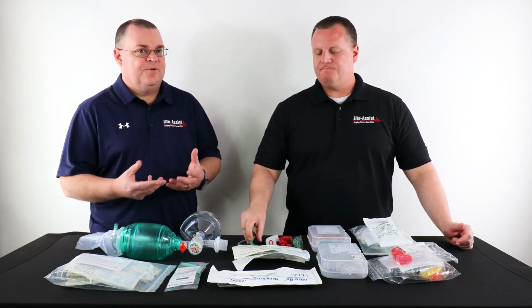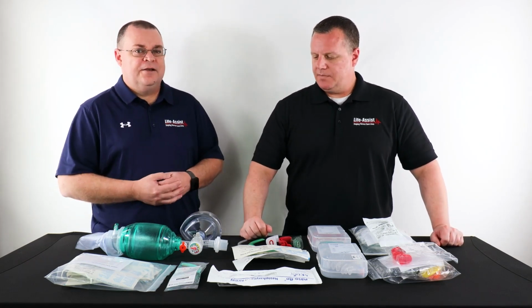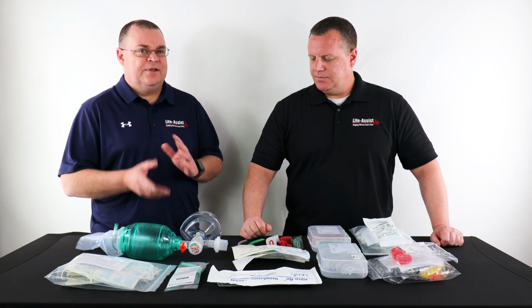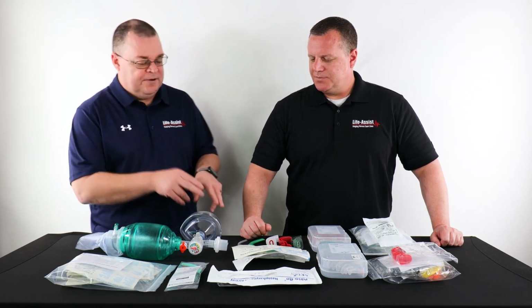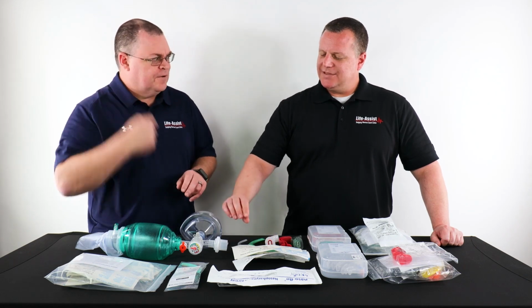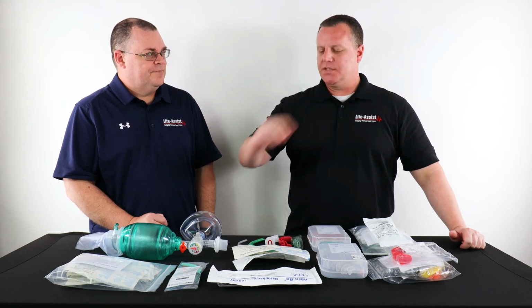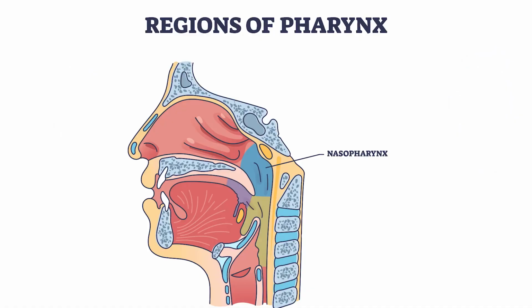It depends on what signs you're seeing from the patient and what's going to be the most beneficial for them. And what's the target you're aiming for with the nasal? Are you aiming for the same place? It's eventually going to end up in the same place, down at the base of the tongue. But remember, this is inserted in the nose, so instead of the oropharynx, it goes into what is called the nasopharynx.